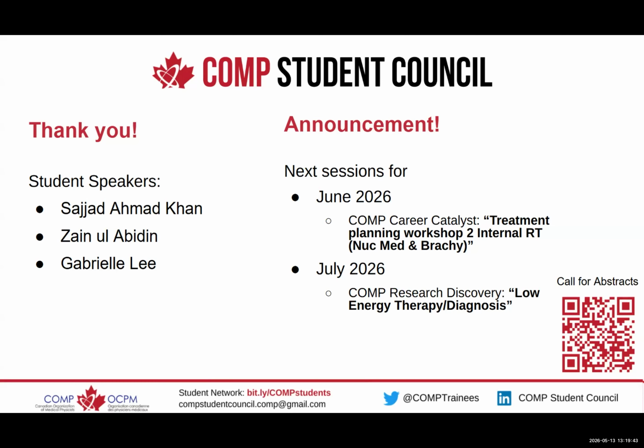I'm just wondering, let's say you can't get to the MR to read this out fast enough because you're in a clinical setting and someone's using the MRI to make actual scans and you have to read it out at midnight or something. Is there a way that you could... but I guess never mind, because then you wouldn't have the initial reading to deform to. Yeah, that's why I usually do my experiments in the evening when we don't have any patients, because we want to make sure we're scanning within the 30 to 40 minute timeline. With MR acquisition, it usually takes about 10 minutes to scan them. Right, okay, sounds good.